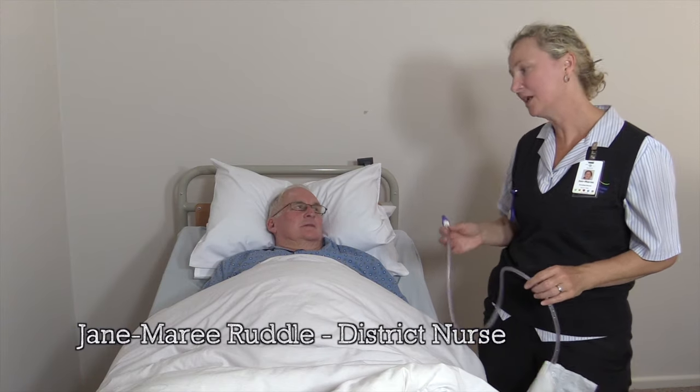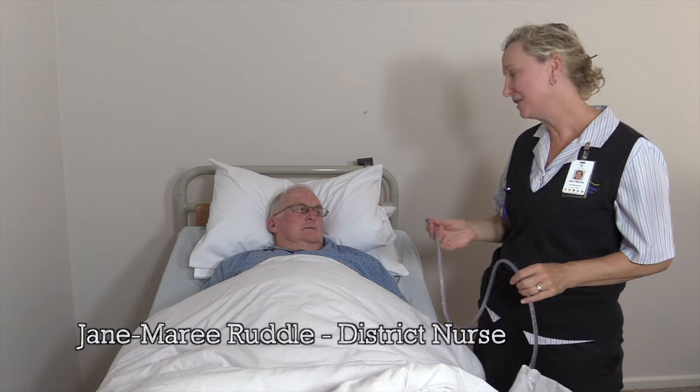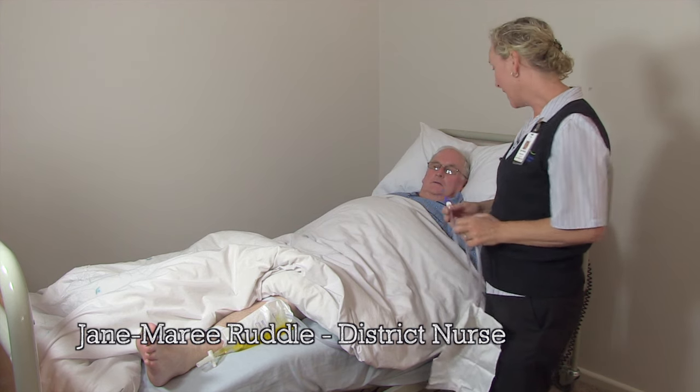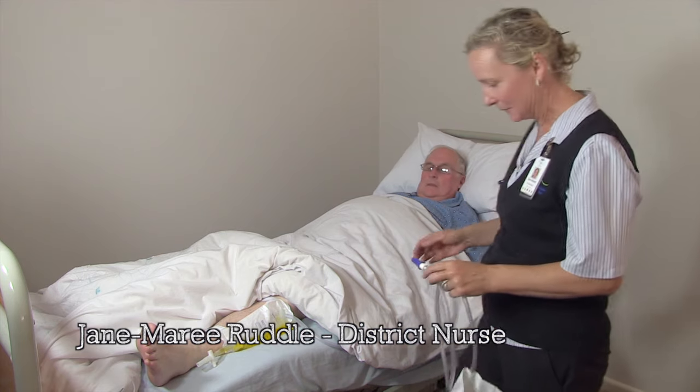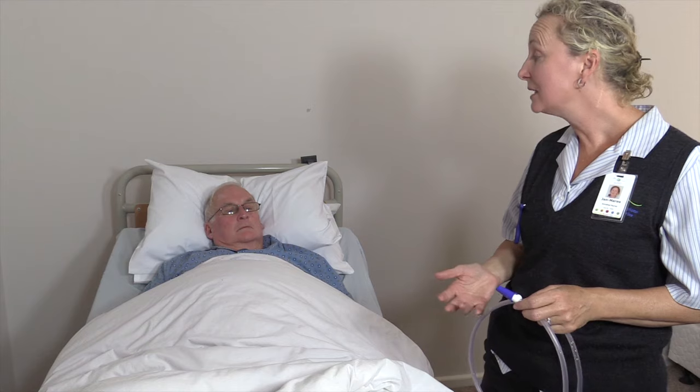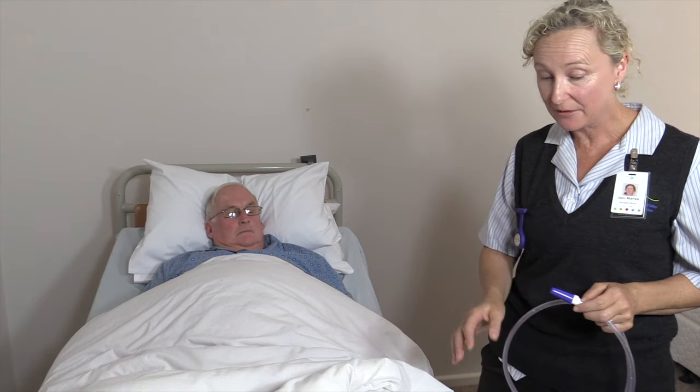Hi John, I'm Jan Marie and I've come to talk to you about your catheter bag. Your catheter drains the urine into a bag so that you can empty it. It's important that you wash your hands before you change your catheter bag.